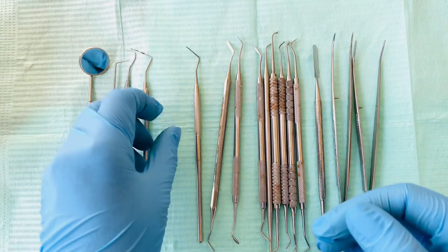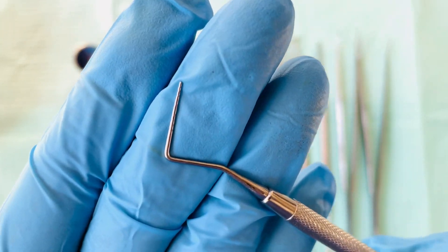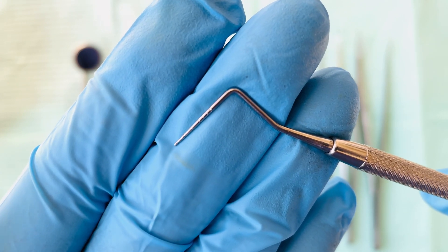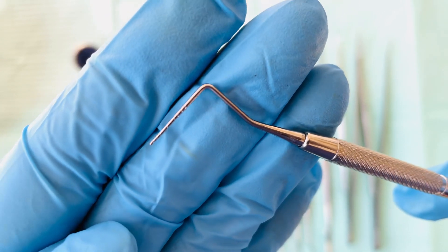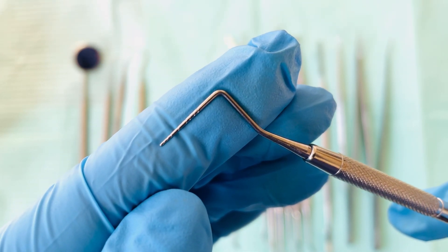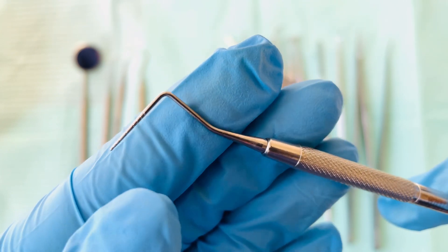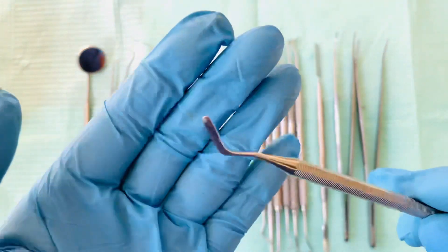Next we have the Williams probe. It has 10 millimeter markings — you can see those marking lines. This is used to do a six-point pocket chart. So if the clinician detects that the gums have periodontal issues, they will do a further check using the Williams probe.